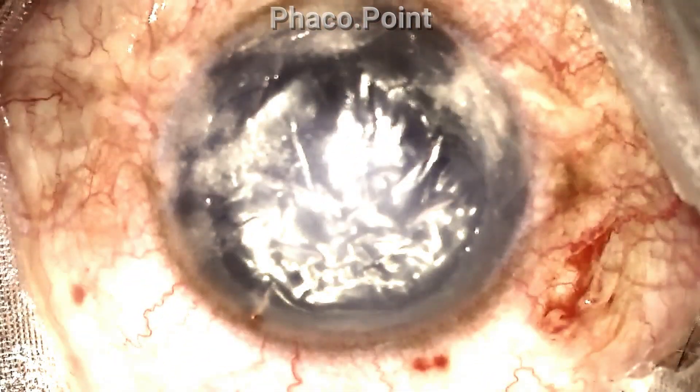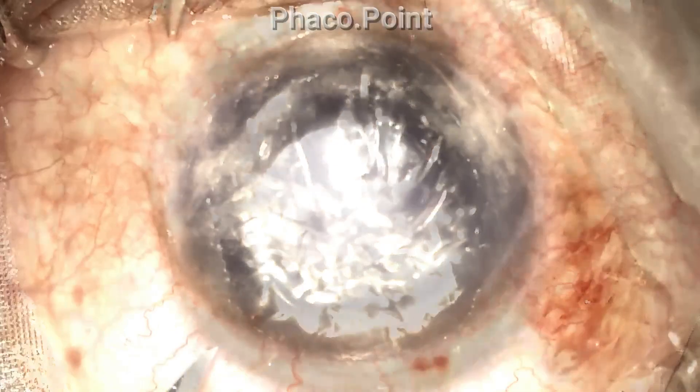At the end of the desmetopexy procedure, you would ideally want to see a completely clear cornea. But as you can see here, even though some part of the cornea seems to have cleared, there still are a lot of corneal folds clearly visible. I now attempt to try and flatten out these folds.